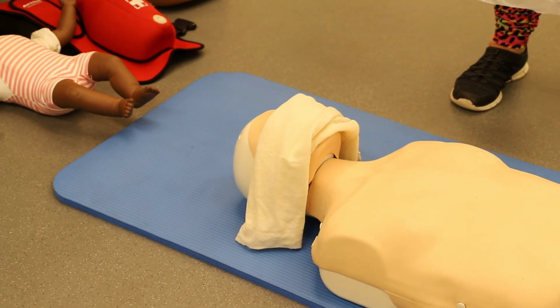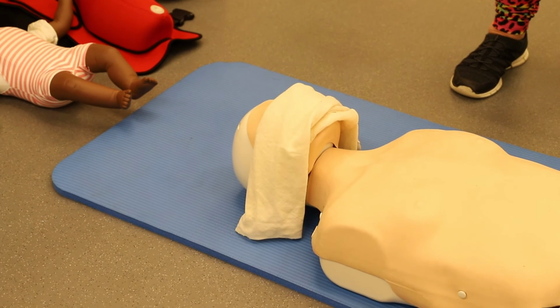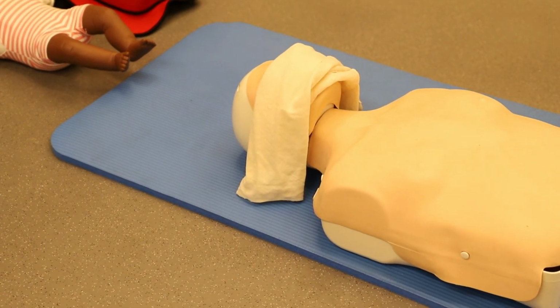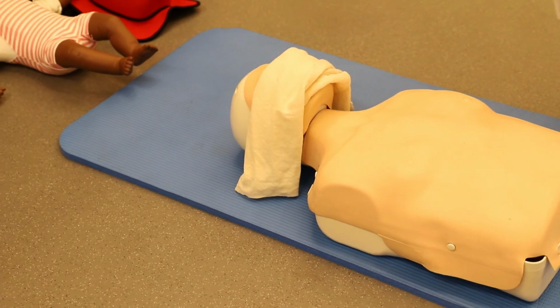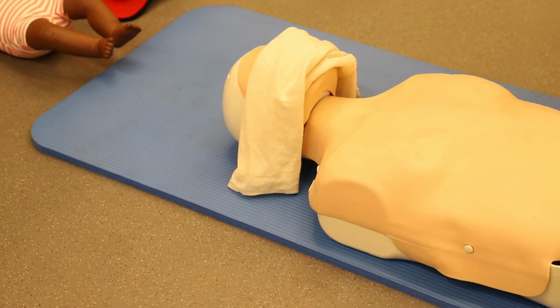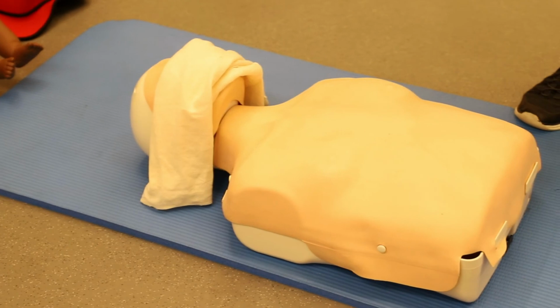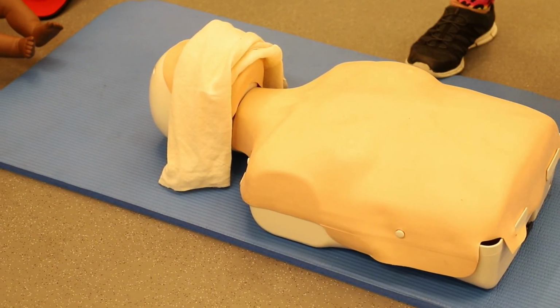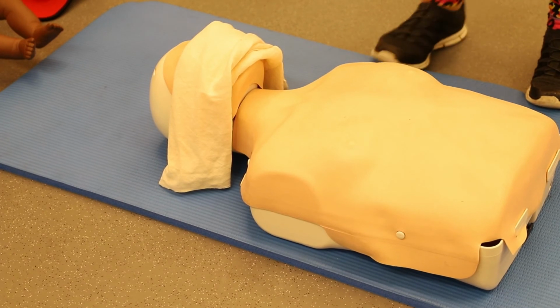And then we need to check for response. But this time I don't want to get so close to my casualty, so I might be tapping them on the bottom of their foot to see if I get a response from them. Okay? There's no response from my casualty, so now I need to check if they're breathing.